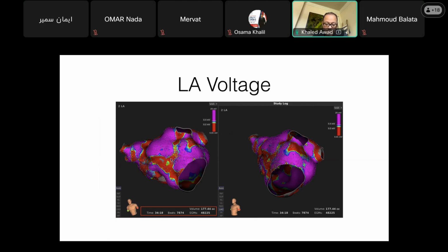Not necessarily crazy high, but in older patients, that can be really easy to do. It doesn't take much to cause perforation if you are delivering RF with high power, like 40 watts. So you can't have 25 grams of force, especially with an SF catheter. A lot of people don't use SF catheters anymore, but Q dot is probably a little better.